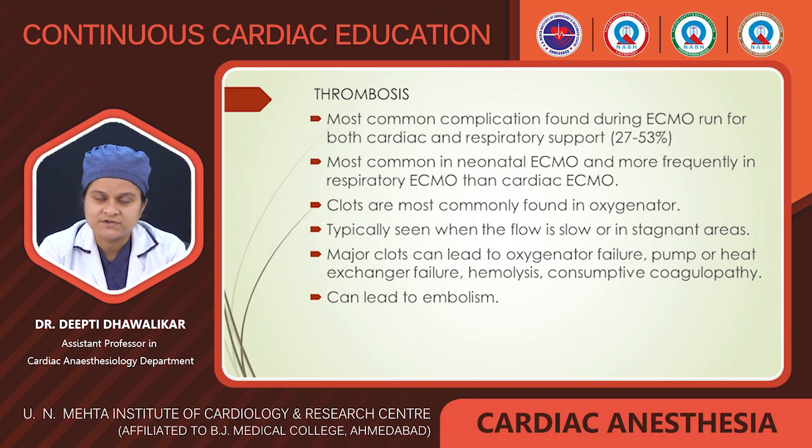Clots are most commonly found in oxygenator. They are typically seen when the flow is slow or in stagnant areas. Major clots can lead to oxygenator failure, pump or heat exchanger failure, hemolysis, and consumptive coagulopathy. It can subsequently lead to embolism.